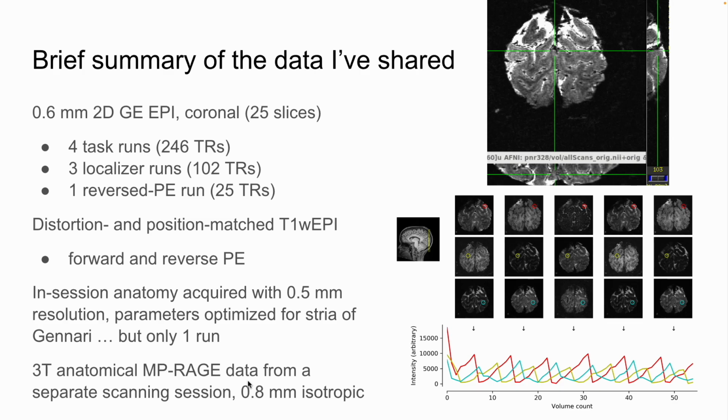The bands, like the narrowness with which you can specify the separate RF pulse that excites the different slabs for simultaneous multi-band excitation, those slabs can't be skinnier than about 3-4 centimeters. So when you're doing super high-res work with really skinny slices and you're limited to how many slices you can get per slab, we can't use multi-band acceleration because it just sends our G factors through the ceiling, because we end up with cross-excitation between the bands, and it kills your signal-to-noise ratio. Hence the really limited coverage, even though it seems like I should be able to multiply that times 4 by turning on multi-band 4. I've got 32 receive coils. You can't.